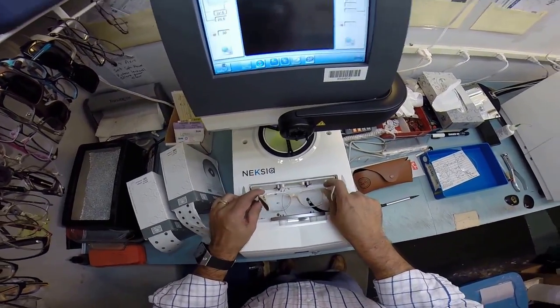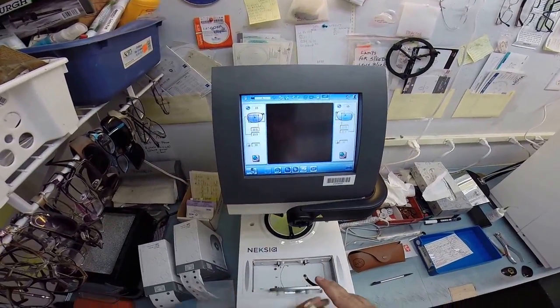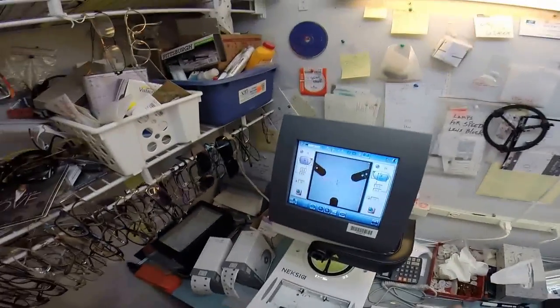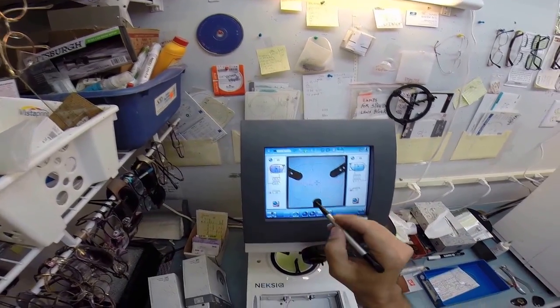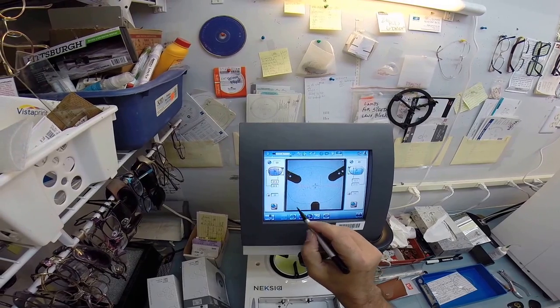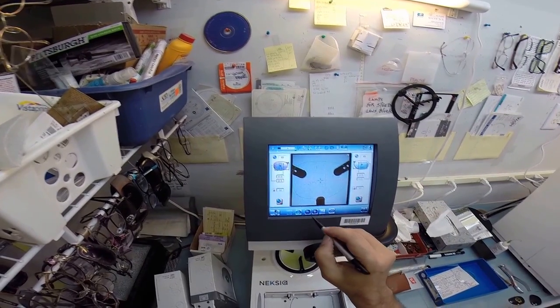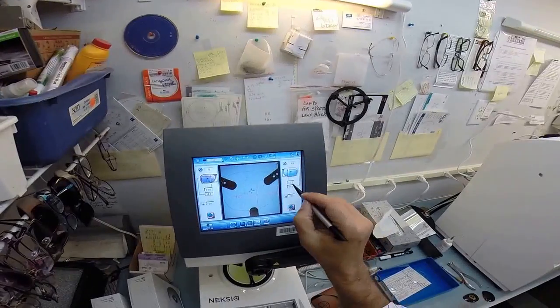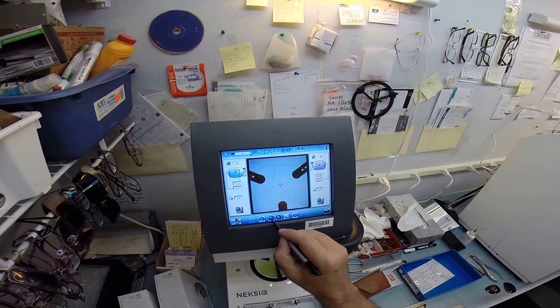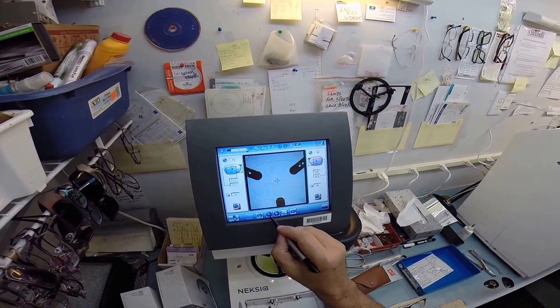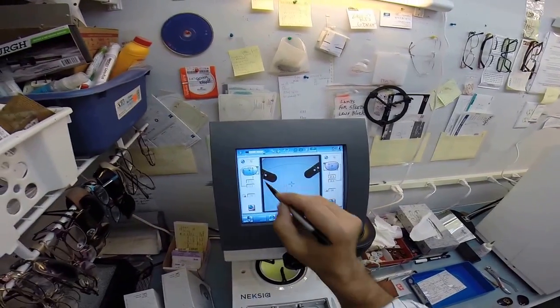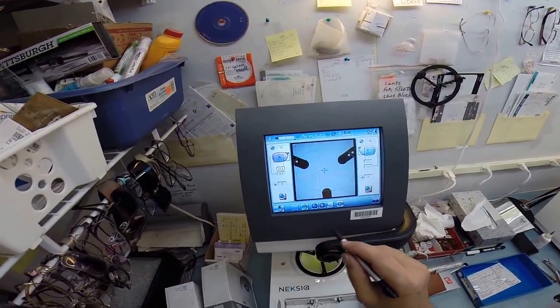Let me take this out. In just a moment your shape is going to pull up and let's type in some measurements. I'm going to put in 31 there and we're going to go at 16 for your seg height. Let's go over here to the left lens. Type in all stuck on 16 there. Change one more modification there. Back to the right lens and we're good.